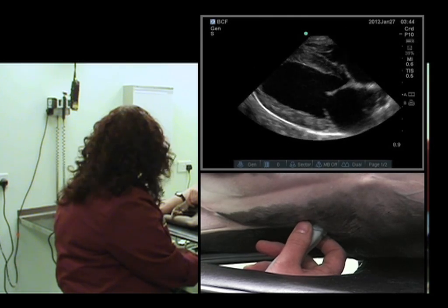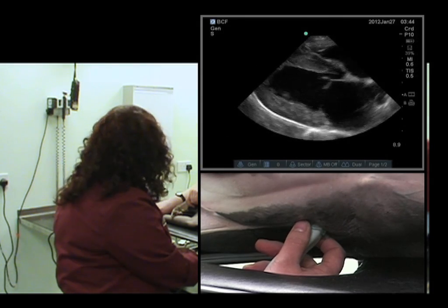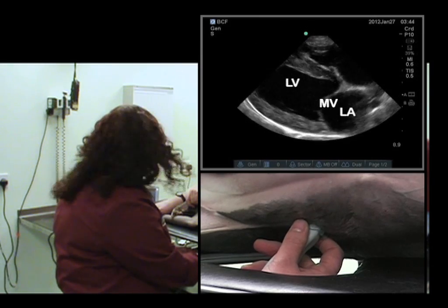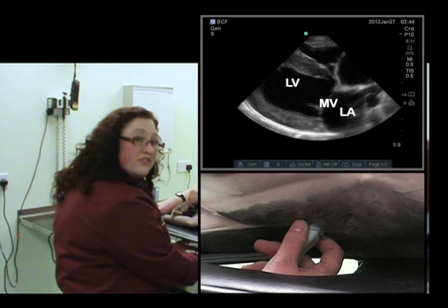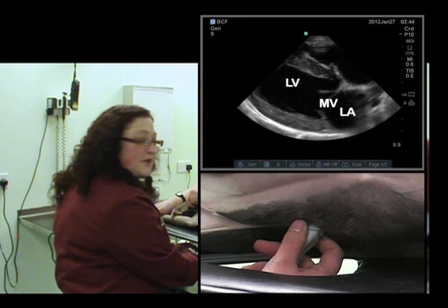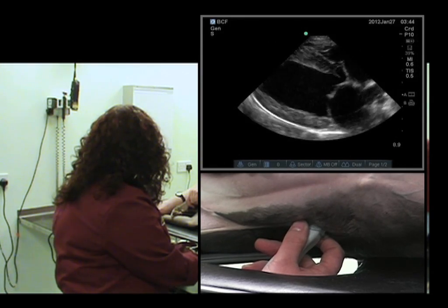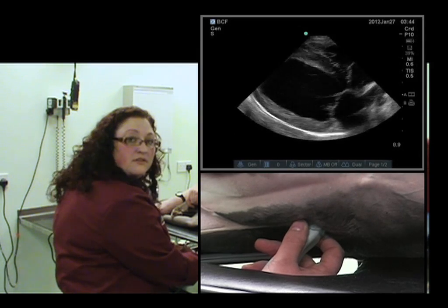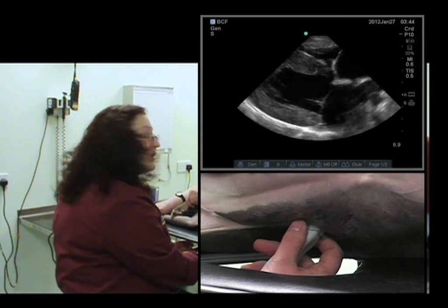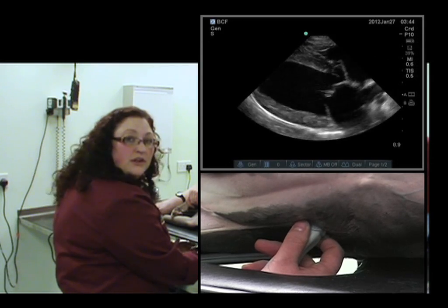And that's a much better view. We can evaluate various structures on here, including the left atrium, the left ventricle, the mitral valves, and the right atrium and right ventricle to some degree. We're really wanting to look at the left side particularly on this view — looking at contractility, how much the heart is actually doing its job. We can also evaluate the mitral valve leaflets and chamber size.